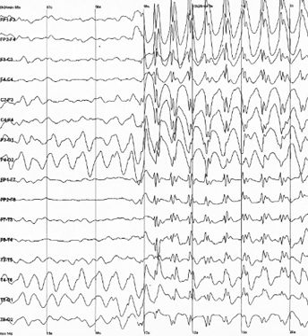Recently, a combined EEG, MEG, EMEG approach has been investigated for the purpose of source reconstruction in epilepsy diagnosis. EEG has also been combined with positron emission tomography. This provides the advantage of allowing researchers to see what EEG signals are associated with different drug actions in the brain.